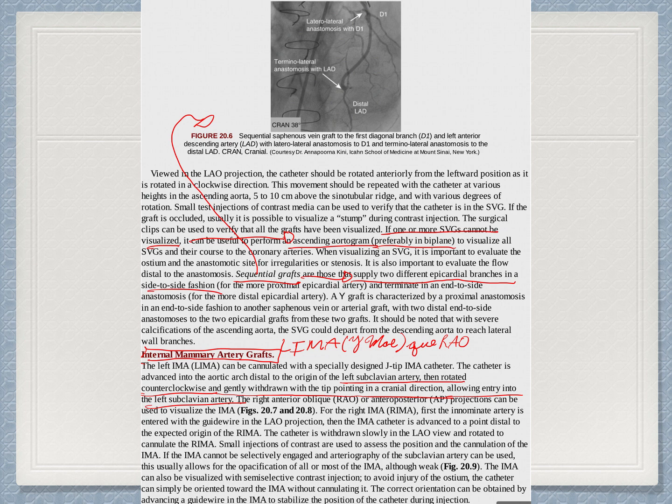The internal mammary artery, or the left internal mammary artery, is usually engaged in the RAO position, in the RAO projection. Then Lima que Rao.